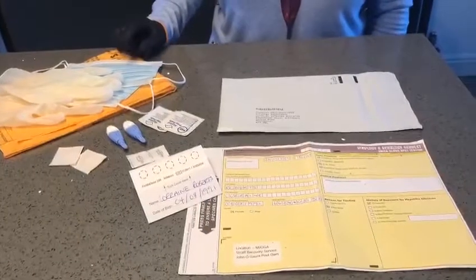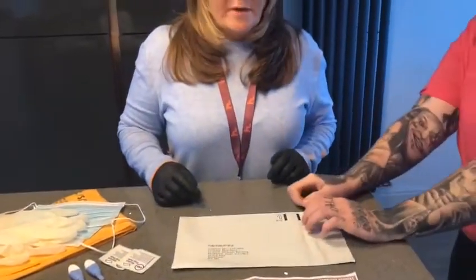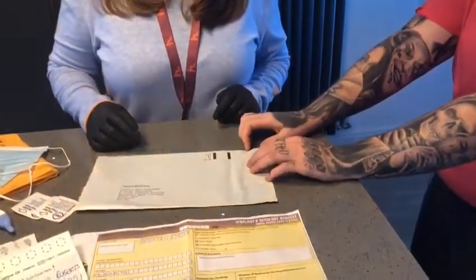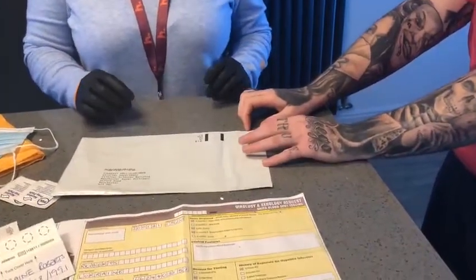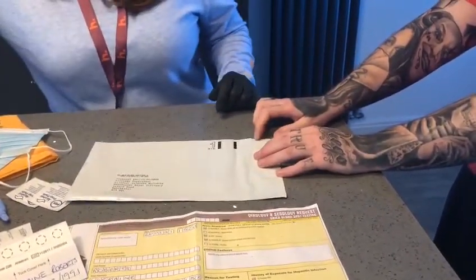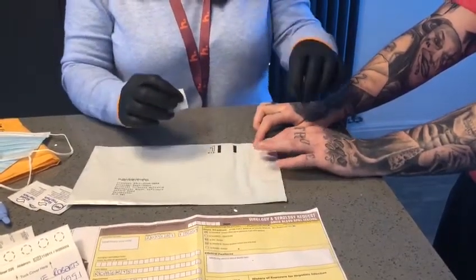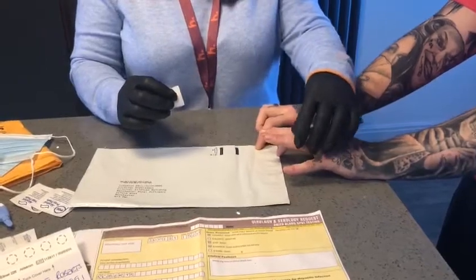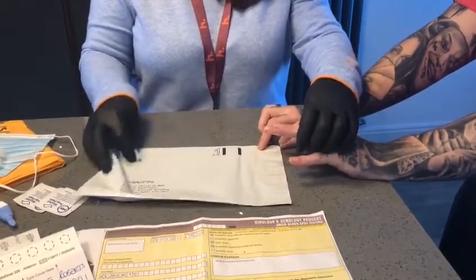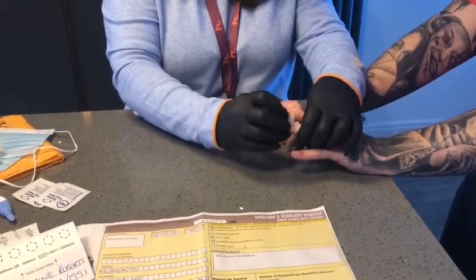And of course, you need to be using the appropriate PPE. So the first thing that you need to do is to ask your client to wash their hands in warm soapy water. Or if there isn't any warm soapy water available, then use an alcohol wipe after checking that they're not allergic to alcohol and they're not on blood thinning medication. So take the chosen finger and wipe it on the inside with an alcohol wipe.